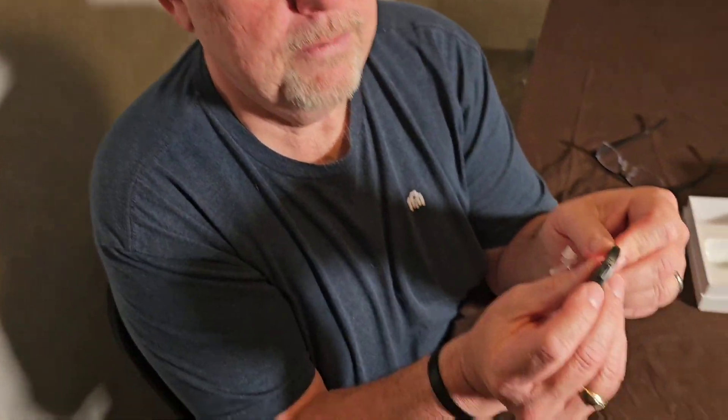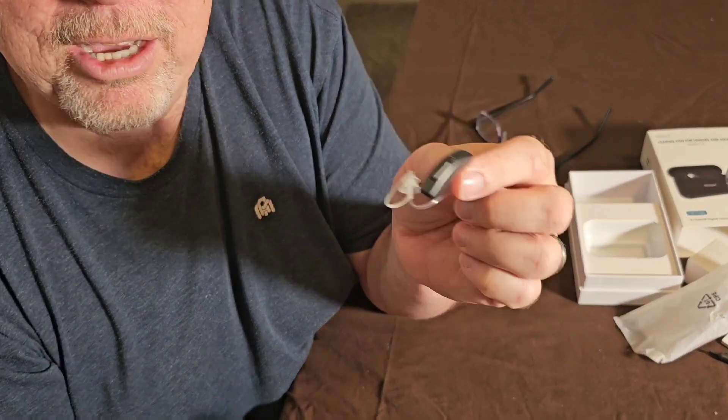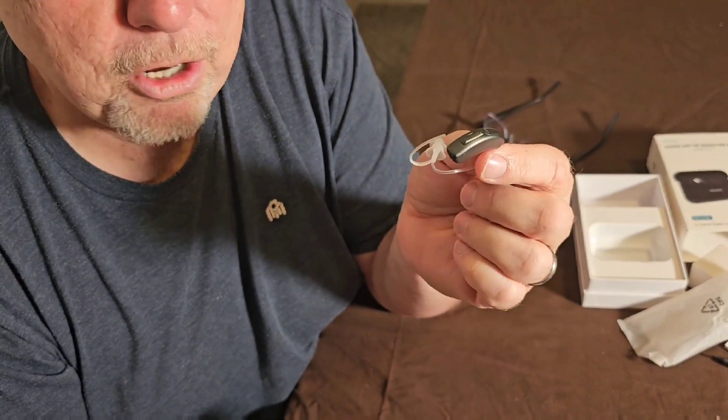I'm going to take one out and show you how easy it is to put in my ear — I haven't had one in my ear yet. When you take them out of the case, they automatically turn themselves on, which is awesome. And when you put them back in the case, they automatically turn themselves off.